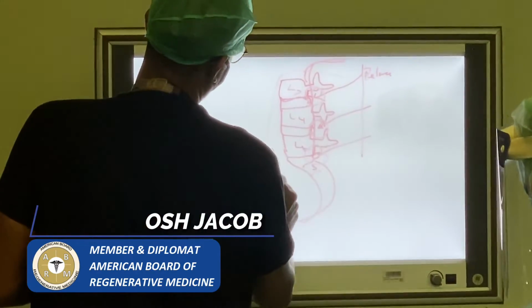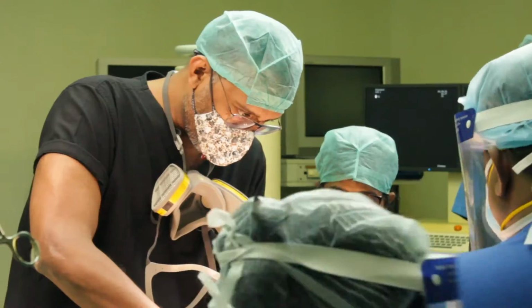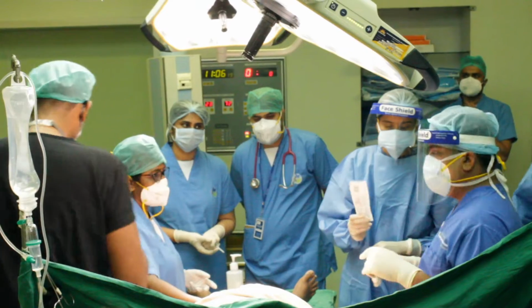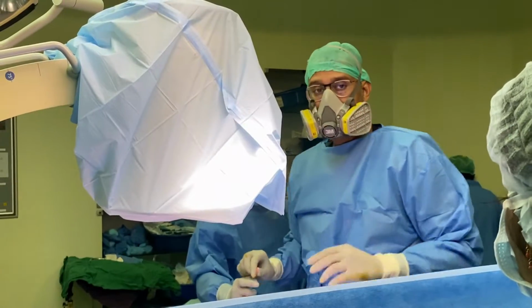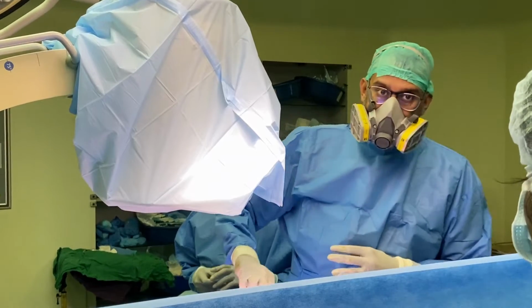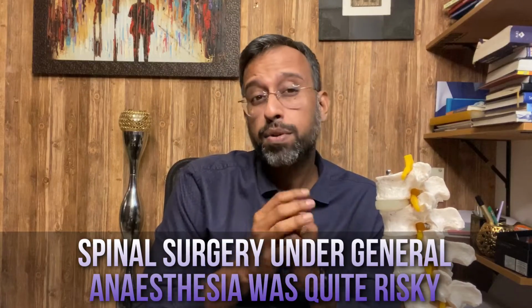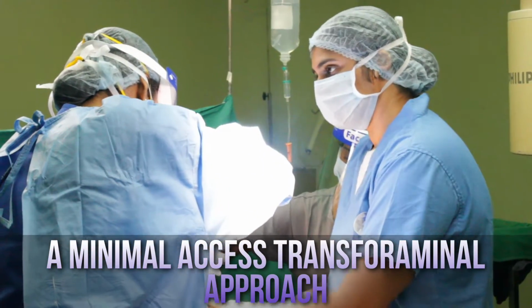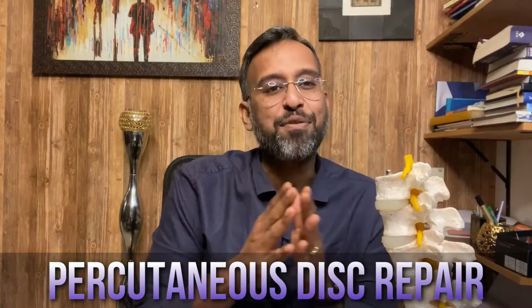She had severe low back pain for the last few months, but over the last 3 weeks it had increased much more, and I had also treated her with anti-inflammatory and a lot of drugs to reduce the nerve pain, but it didn't help. And as spinal surgery under general anesthesia was quite risky, she asked for an alternative which was safer. And after talking to her family, we decided to do a minimal access transforaminal approach, percutaneous disc repair for her. Yes, the name sounds very confusing, but when I explain what it is, it will be really interesting and exciting. So what is this process?